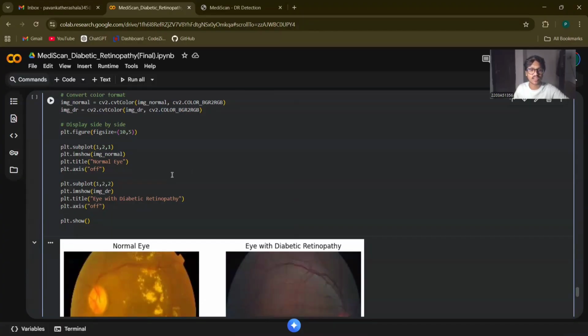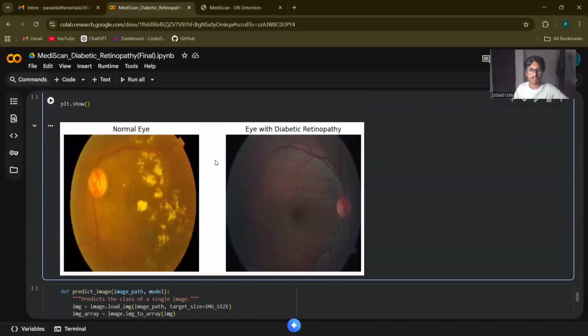So this output is a clear visual comparison of the two most important classes in our study: a healthy retinal image and a retina exhibiting signs of diabetic retinopathy. This visual step confirms our data is loaded correctly and lets us see the pathology our model is trying to detect, features like tiny hemorrhages or exudates that are key indicators of DR.